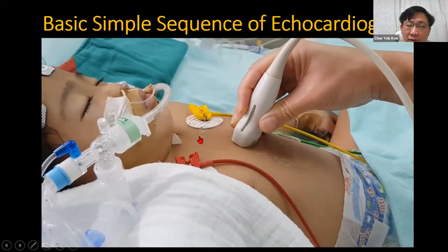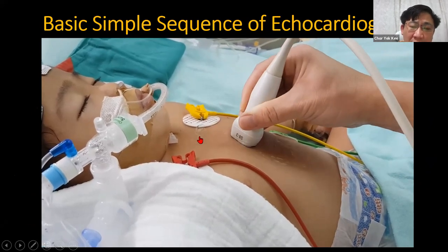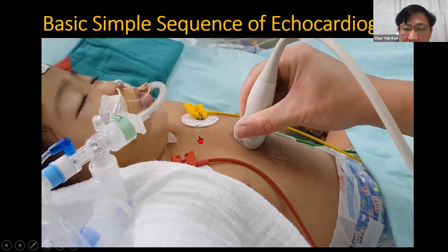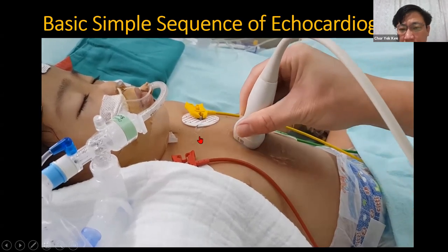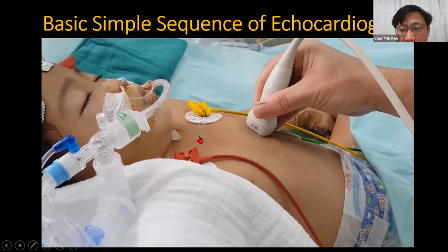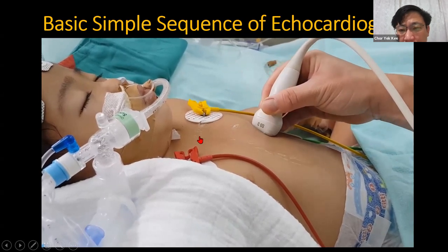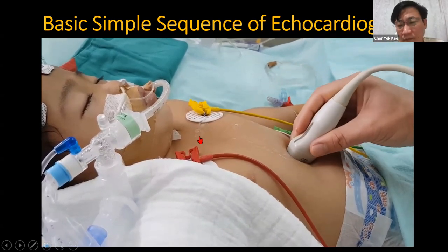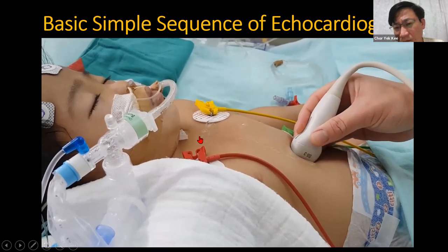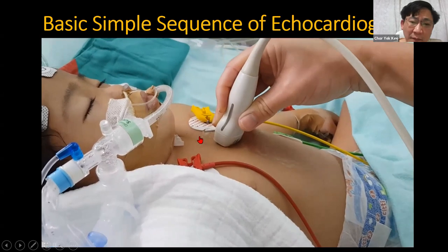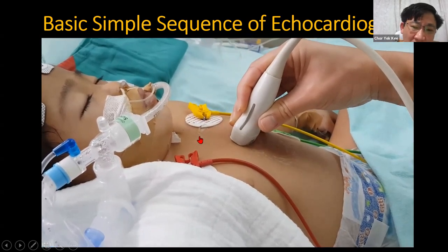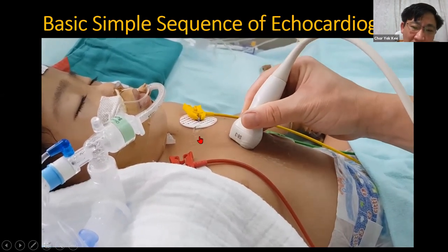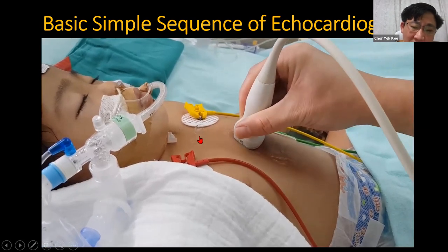After knowing all the views, here is a basic step-by-step process for performing an echocardiogram. Start from the parasternal position with the pointer pointing towards ten o'clock — that gives you the long axis. Then turn the probe 90 degrees to get the parasternal short axis view. Swing the probe up or down for different short axis views.